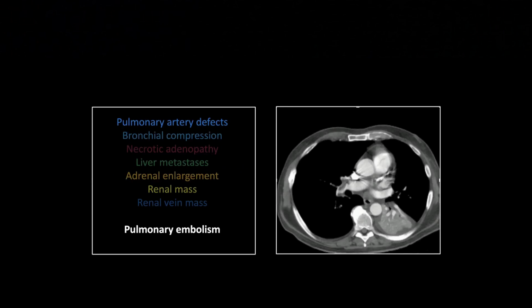All right, this is quite a case. The thing that was interesting about this is you may know, as a teleradiology practice, we run a lot of artificial intelligence algorithms. We're very smart about the algorithms we chose to build, and they've all been chosen on one of two things, basically: medical malpractice risk, right? The cost of missing a given finding, and our quality assurance data that shows us what are the most commonly missed things that we see.